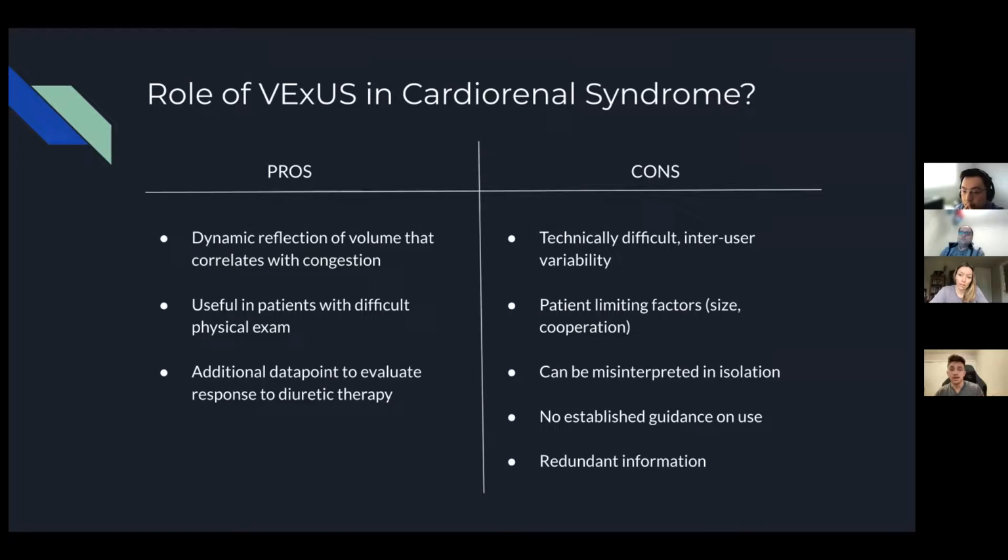Probably not. And as you diurese the patient, ultimately the important things are clinical symptoms, urine output, weight. Are those things good enough? And is VExUS then just redundant information? So that's what I wanted to talk about.